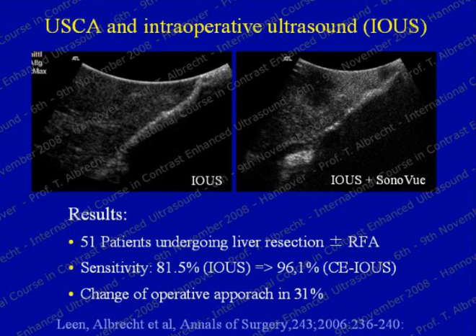These are, of course, not new metastases. They were there before because they came from the primary tumor. The primary tumor is gone, so they can't possibly be new metastases. They're old metastases that were too small to be seen. And with using intraoperative contrast-enhanced ultrasound, we are starting to detect at least some of them.